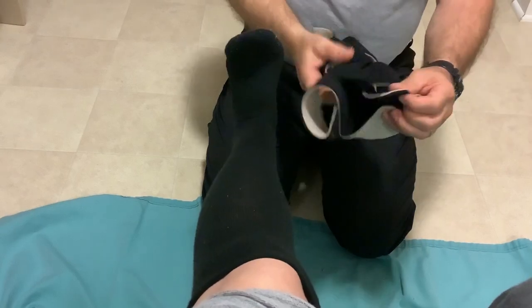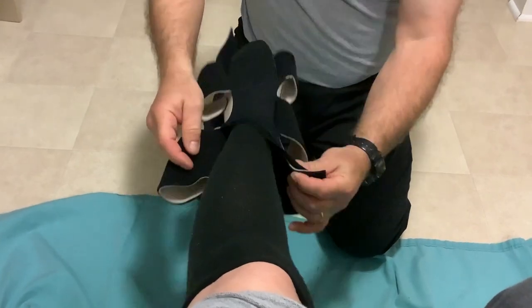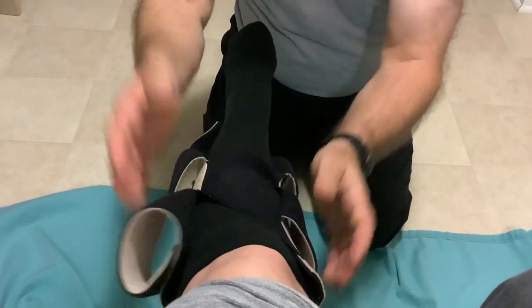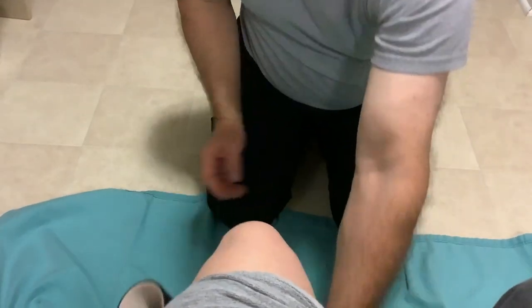Then we're going to use the Velcro Wrap. This is reversible, so it can be black or beige — we're going to use beige today. Slide it right at the leg; it's got a silky liner that will help hold it in place. Bring it all the way up as high as you can, then bend the knee. Make sure it's not bending into the crease of the knee — it needs to lay nice and flat.